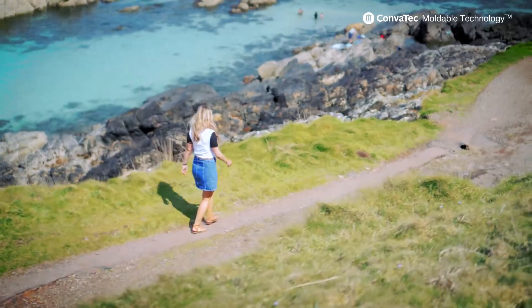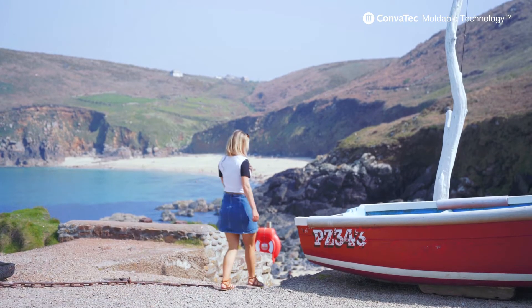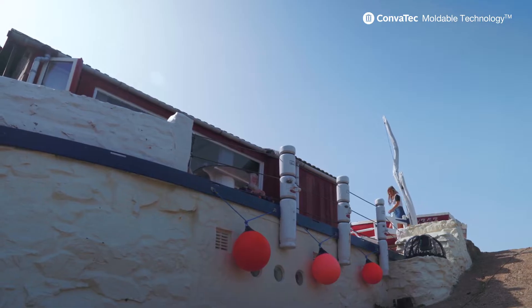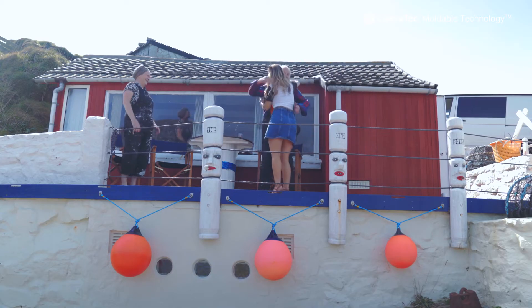I was actually out for dinner and I had a ball gown dress on and my stoma had never done this before — it prolapsed basically, which I didn't know what that was at the time. I realised the product had moved with the stoma, which was amazing. When it went back to normal size, it also just moved back and it still didn't leak. It really tested the pouch and the system.